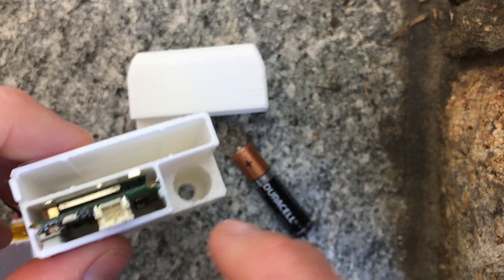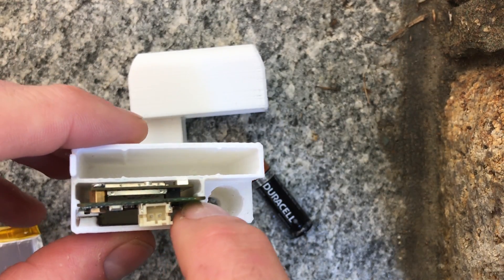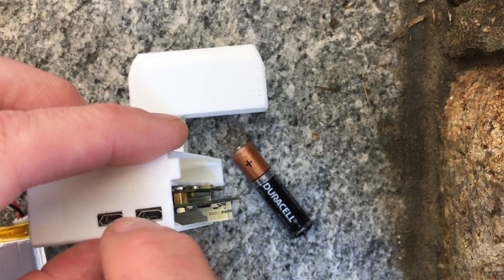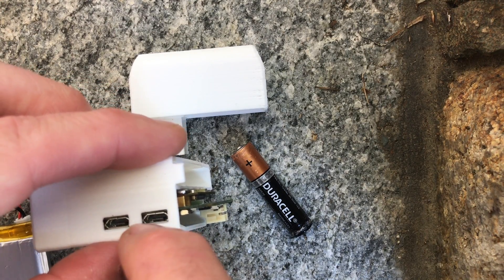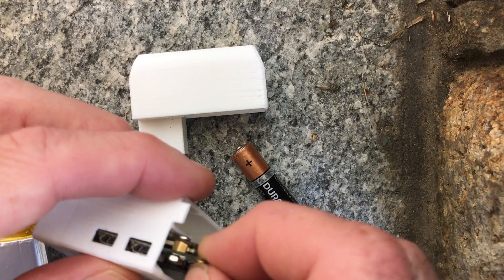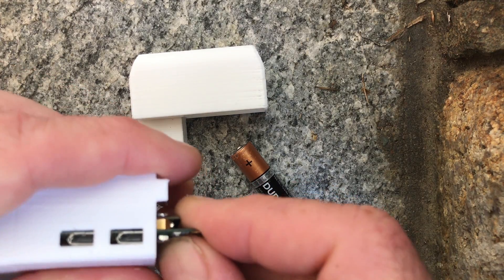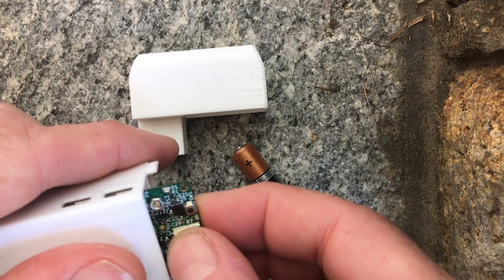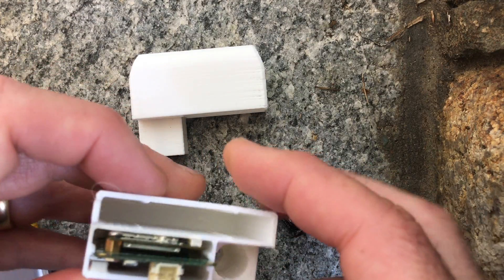If you look at this board, it's actually in a groove here and it fits fore and aft securely. These ports rub up against the plastic by design, so if you want to take this out you kind of have to jiggle it out because the USB ports will catch on the plastic, but you can see that it will come out.